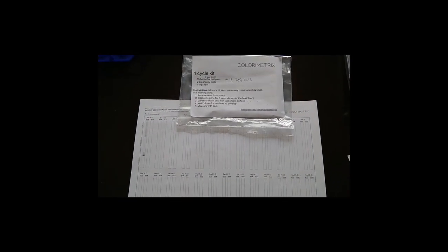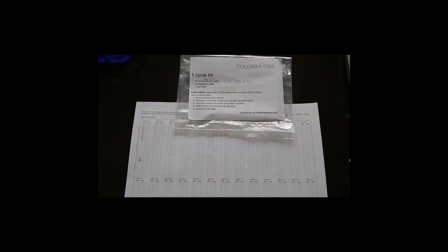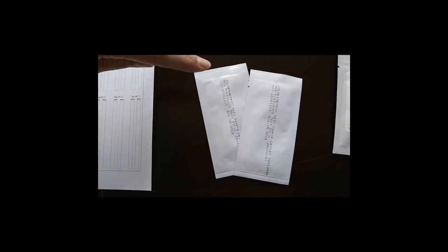Okay, so I'm going to show you a couple of features about the Pearl Fertility Monitoring research study. You're going to receive a welcome kit by mail. Inside the kit is going to be a log sheet. We'll talk about that later. Then you're going to get 15 FSH strips, which is the blue package, 15 LH strips, which is the pink package, 4 PDG, those are the purple strips, and 2 HCG pregnancy tests.